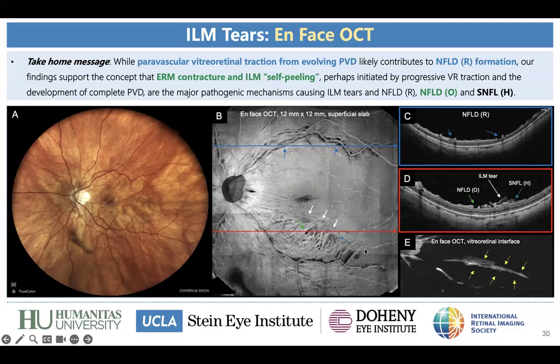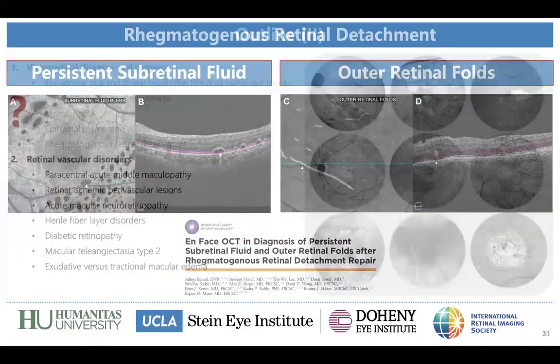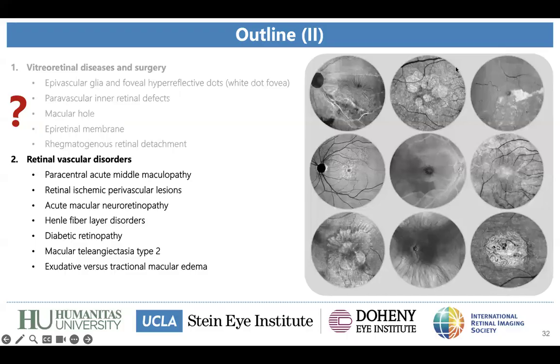So I think this is the most comprehensive approach that we can have, by looking at each segmentation based on the patient's symptoms, and of course correlating it with the cross-sectional OCT, which is always fundamental. Yeah, and it makes total sense when you check the ellipsoid first, or when you start with the deeper segmentation, you can identify shadows and hypertransmission defects, and it allows you to exclude further examination or to go deeper in the investigation. It makes total sense.